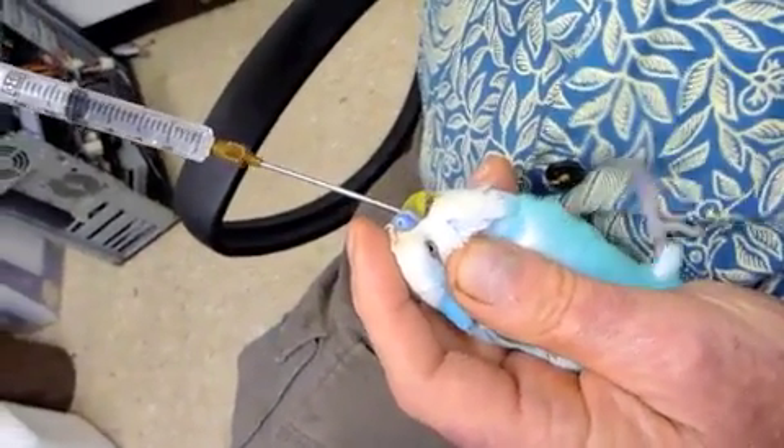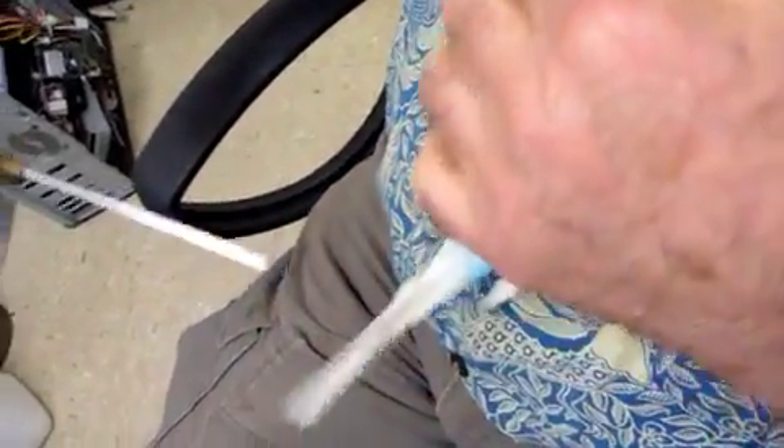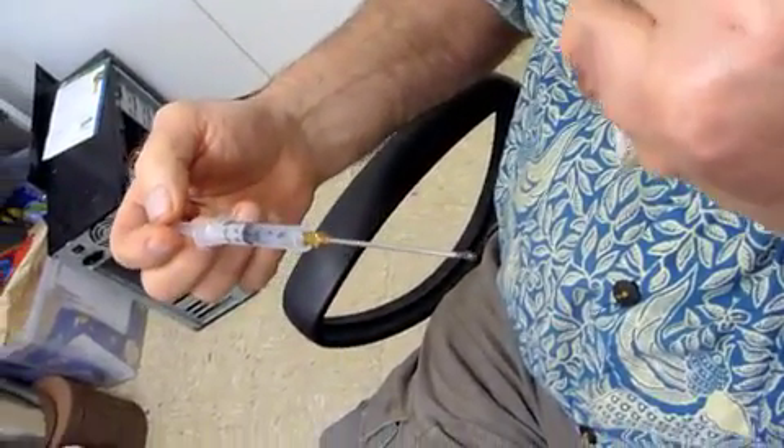I've now got what's called a crop wash. I've taken the needle out straight. I'm sending the little birdie love and I'll just talk to him for a moment — I'll say you're beautiful, you sure are — and then I'll put him back.